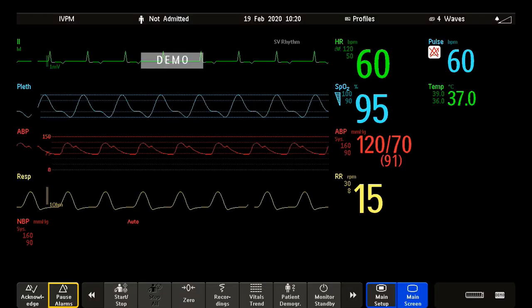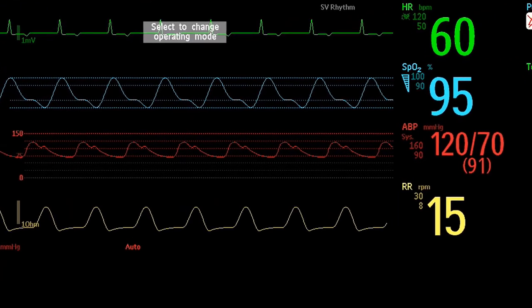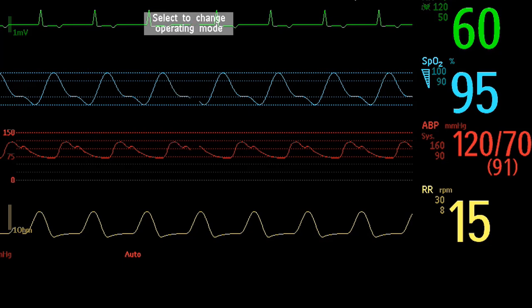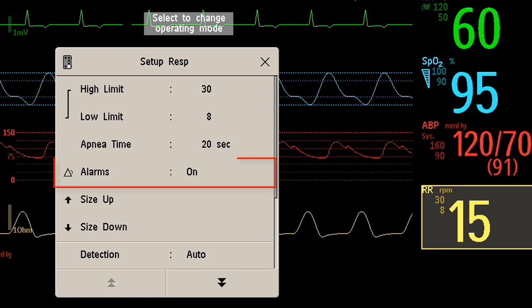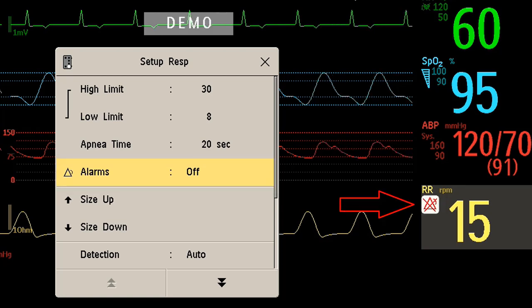Instead of pausing all alarms, you can also switch off alarming for an individual measurement. Let me show you how to switch off the alarms for the respiration measurement. First, I select the measurement numeric to enter the setup menu. Then I select Alarms to switch between ON and OFF. Now the Alarms OFF symbol is shown beside the measurement numeric.